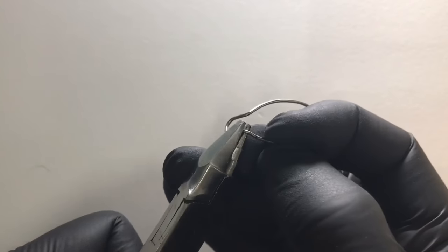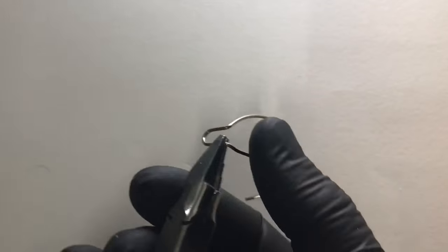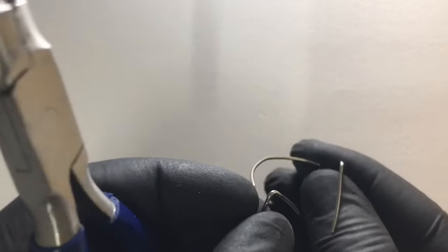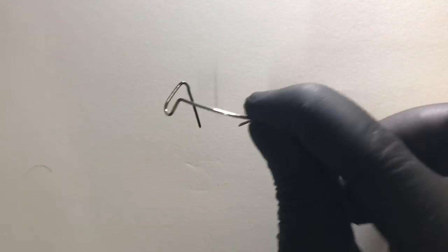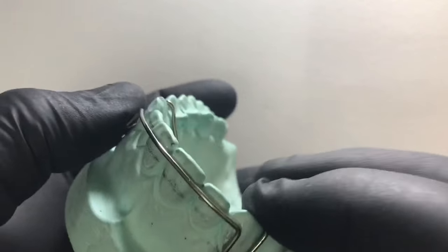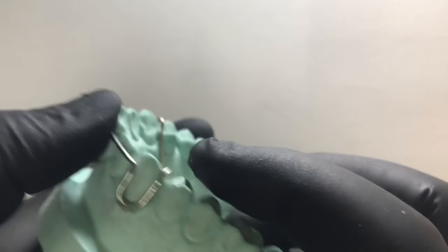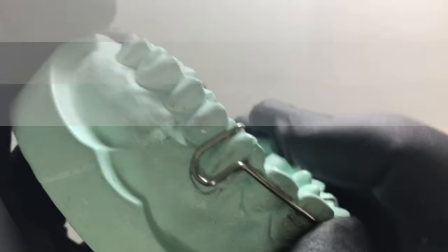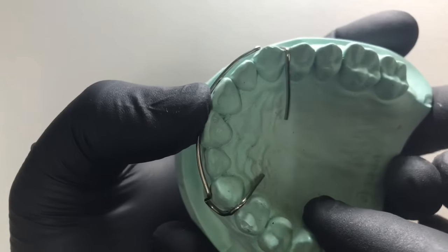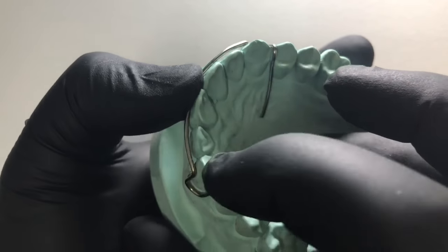We give a complete bend as much as we can with the help of the round beak of the universal plier. Now we can check it on the cast. Remember to have a passive fit at every moment — it should not have a spring-like adaptation. Now we have a good adaptation at the palatal aspect of the retentive arms, and the arch or bow is completely touching the central incisor and the canine.